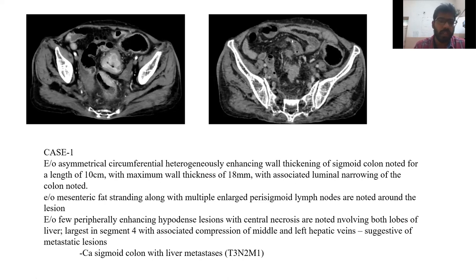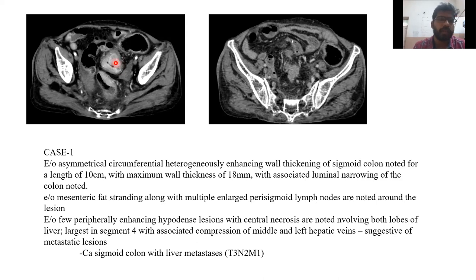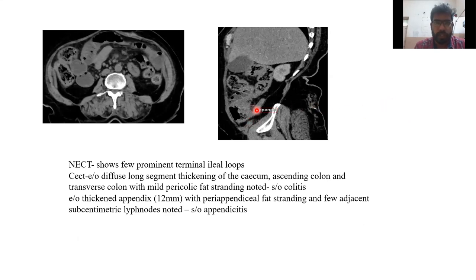This is the first case. We can see asymmetric circumferential thickening involving the sigmoid and descending colon of varying length. In this case, there are also metastatic deposits in the liver — a case of carcinoma sigmoid colon staged as T3N2M1. In another case, there is thick diffuse long-segment thickening of the cecum and ascending colon with features of colitis.